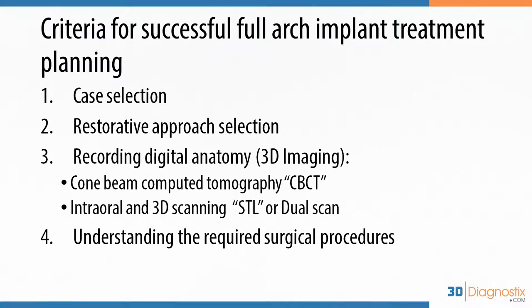Understanding the required surgical procedures is instrumental to implementing the treatment plan. This could range from an easy flapless procedure where you can finish placement of 6 implants in under 45 minutes to a much more complex surgery where full mouth extractions, full arch flap reflection, and maybe bone reduction will be required before implants placement. Worth mentioning that preparation of your patient, your staff, and the armamentarium will be different depending on the case scenario and the required surgical procedure.